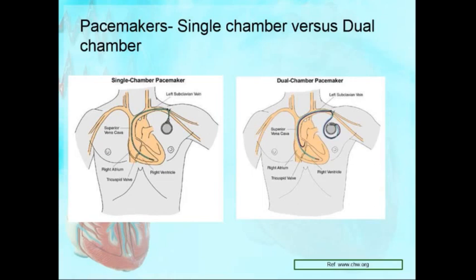Very rarely do patients get a pacemaker lead just in the atrium, because they think, well, what if something were to go wrong with the AV node? I need to put one in the ventricle. Electrophysiologists, we put some atrial-only leads, somebody who's young, all he has is sinus bradycardia, never had an AV nodal issue. I put a simple single chamber pacemaker in the atrial lead. Why? Less hardware, less things can go wrong. One set of screws, one wire is not going to have any issues.